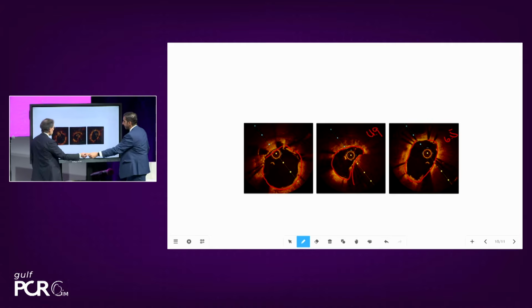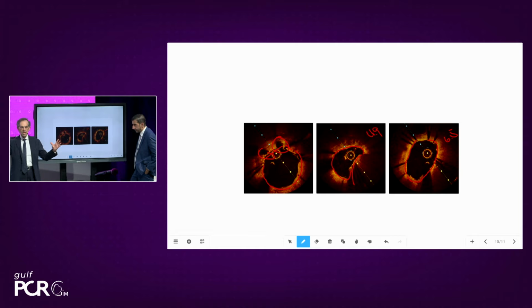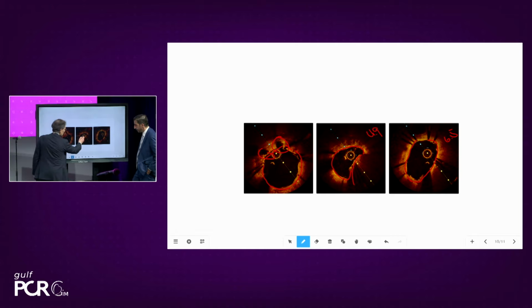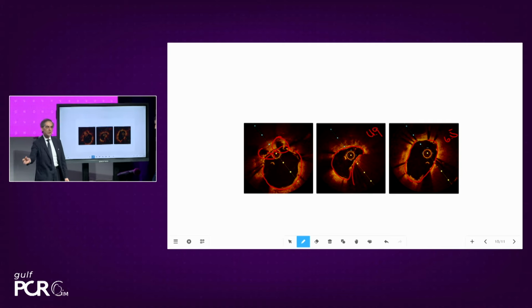Super. So what does it mean? It means that if you crack, you can get an expansion of your stent. If you are not making any significant incision of the nodule, you are going to act only on the opposite side of the vessel. And be careful, because sometimes we insist and we take a bigger balloon.